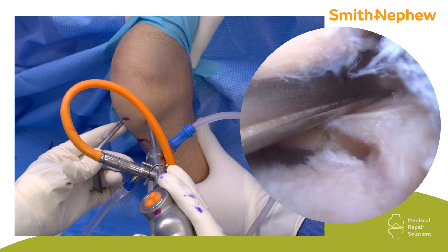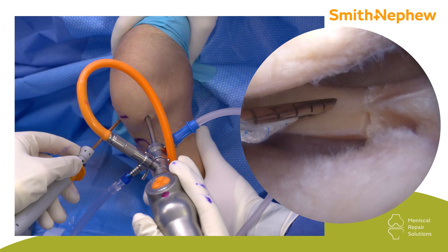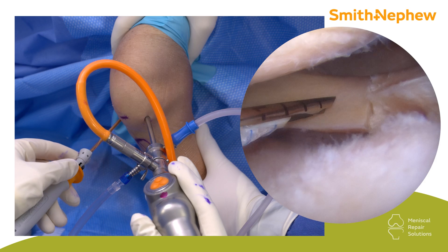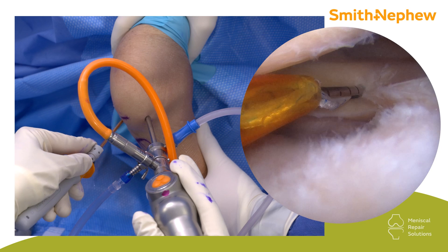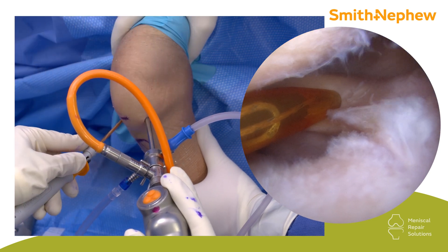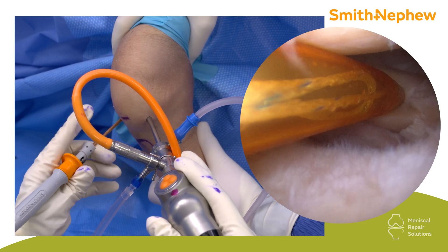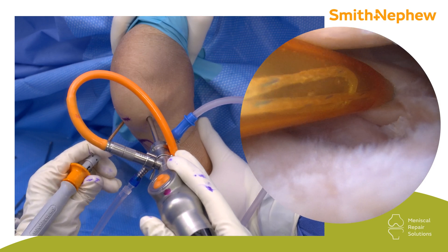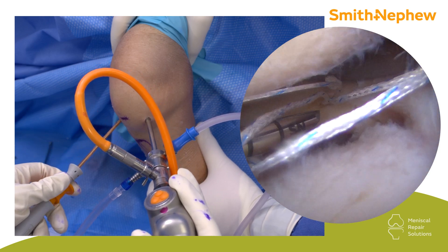Straight posterior from you and very slightly medial is the popliteal artery. When you insert the FastFix, pick your spot and go for it. Don't make five holes in here because every one of them may be a stress riser. You pick one spot, you poke through it, but then tread lightly — as you push through, you don't have to massively create force and push all the way back to the artery. With your middle and index finger, hold the gray part to give counter, and then with your thumb, you slide down the orange part — like so. Now the first T is passed.